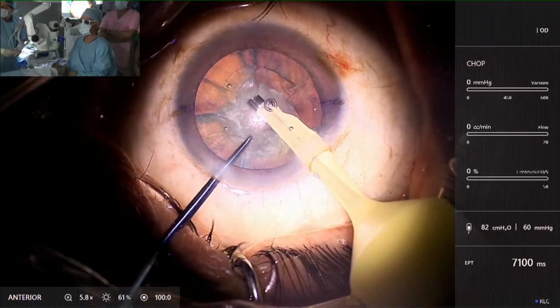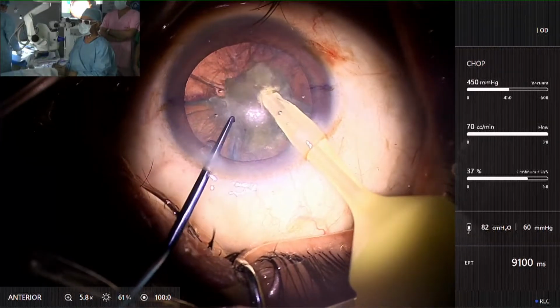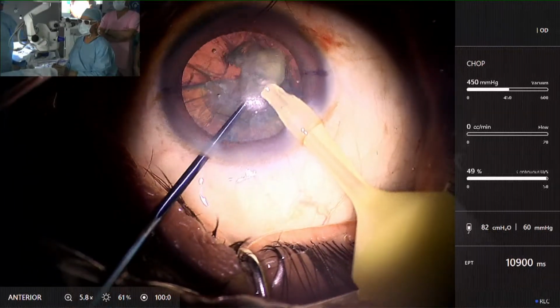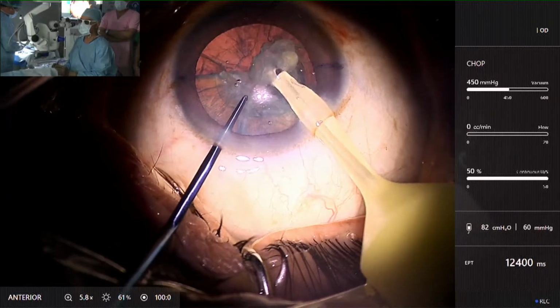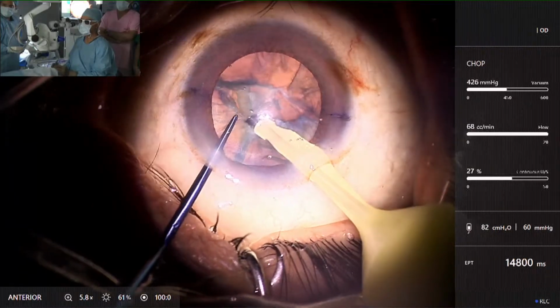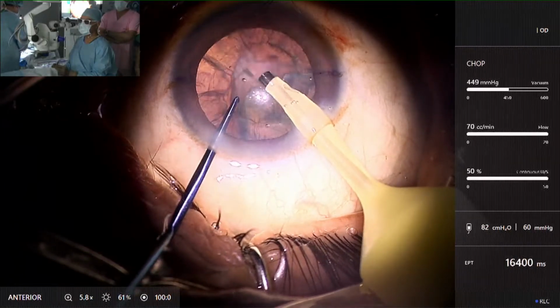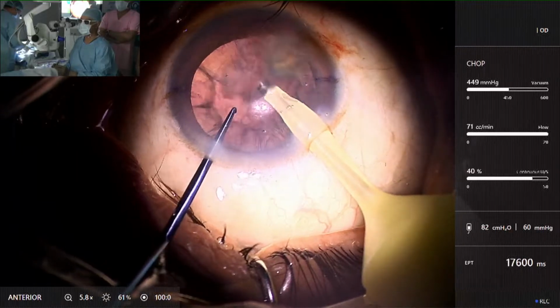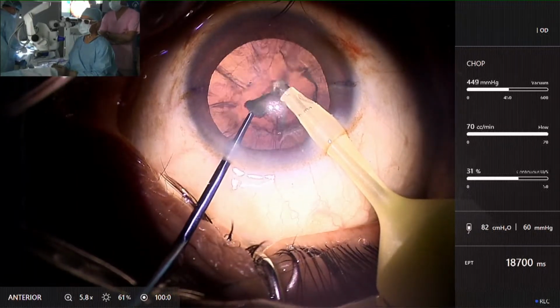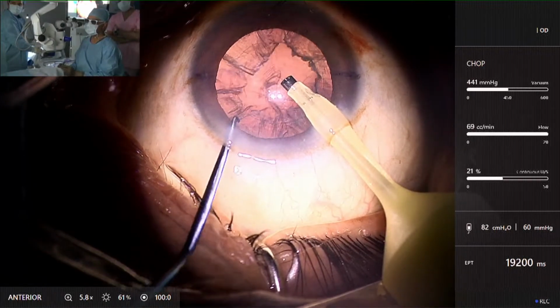So the Cortera is living up to its name, and the 4 pumps work actively to ensure that you don't get a surge at any point. And the followability is amazing. You don't have to go after the pieces, they just come to you. So it's a very different pump from what all the other conventional machines use. And somehow it seems to work very well. I still haven't understood the science behind it, but whatever the science, for us the benefit is a very, very stable chamber.